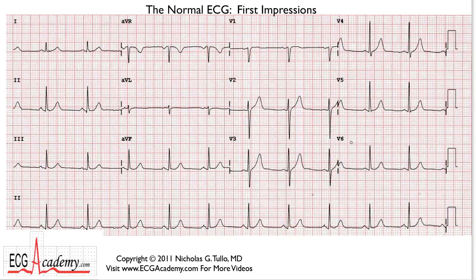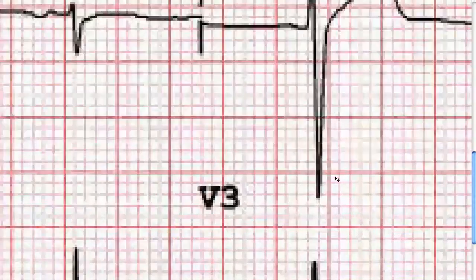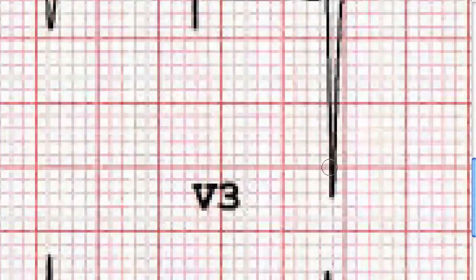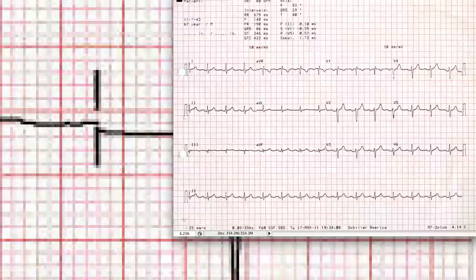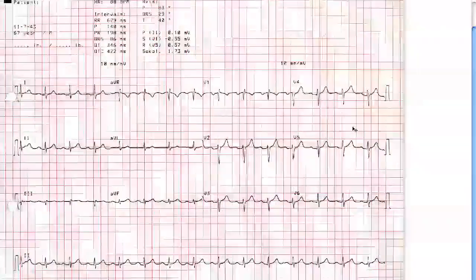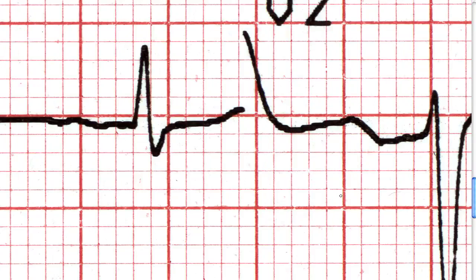This is an ECG that I got off the internet, and it's something that you'd see typically on an ECG website. Now let's zoom in a little bit. I just want you to see what this actually looks like. I think you can tell that this is actually a very low resolution scan of an ECG, and a lot of the details are lost. I just want to show you what I've done is created ECGs in high resolution, done scans of ECGs that are in my own library, and I just want you to see the difference in the fidelity.